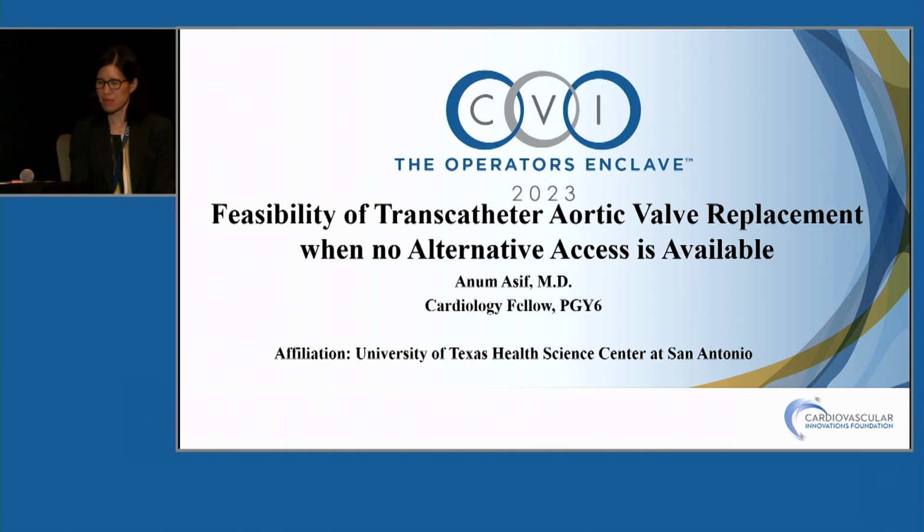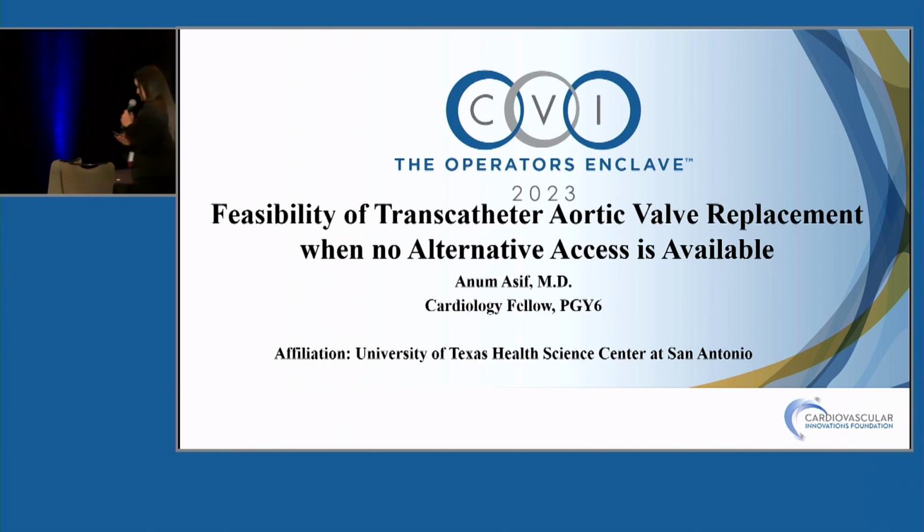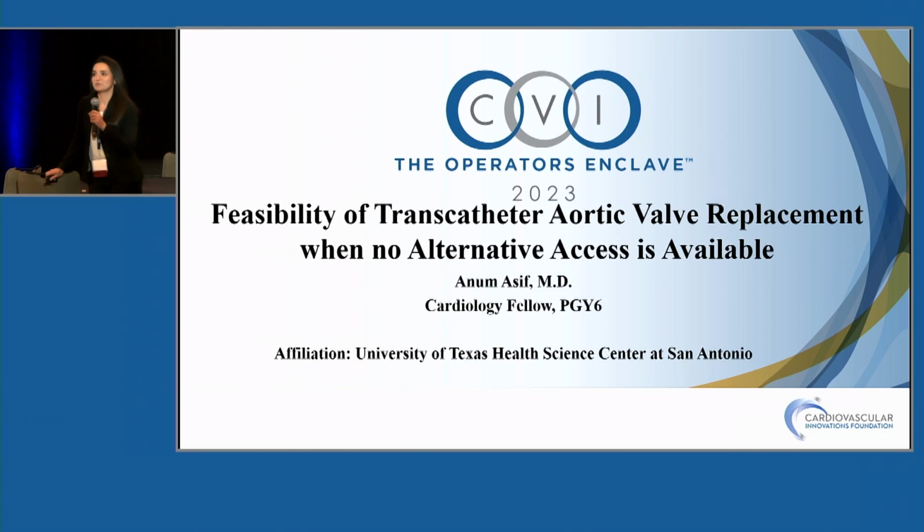Good afternoon. I'm Anum, one of the cardiology fellows. The question I'm bringing today: can you perform TAVR when there is no access? Or is this a mission impossible? Let's see if innovation can help us.